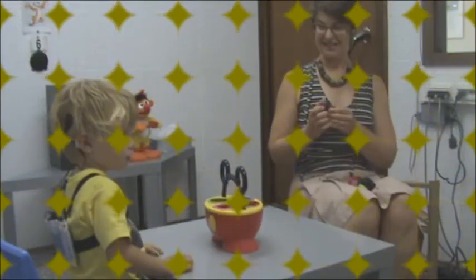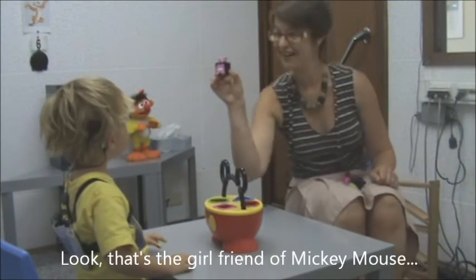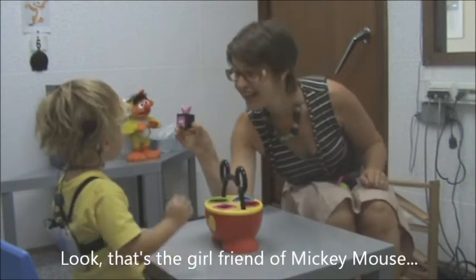When there are doubts about reliability, it's sensible to have a long interstimuli interval. You see Mauro waiting impatiently; however, he only decides to put the block in the box when he really hears the stimulus. He demonstrates the reliability check brilliantly.